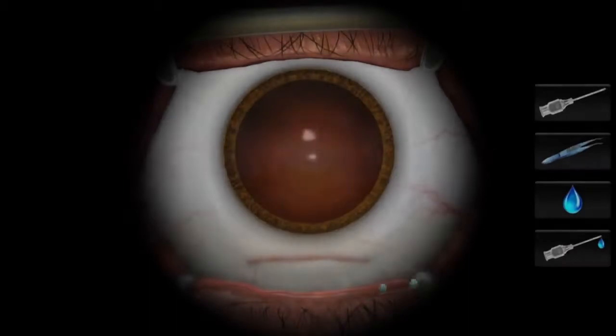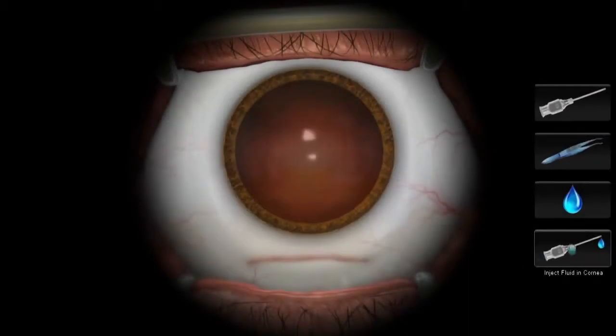The viscoelastic injection into the eye is simulated by selecting the relevant option from the right. As this preview of the simulation is only replicating a sub-step of the surgery, which is the anterior capsulotomy procedure, the scleral groove incision has already been made for us. The cystome is inserted into the eye through the incision point and is slowly withdrawn while releasing the viscoelastic. As the viscoelastic is injected, we can see the pupil fully dilate, and fluid escapes from the anterior chamber out of the incision.